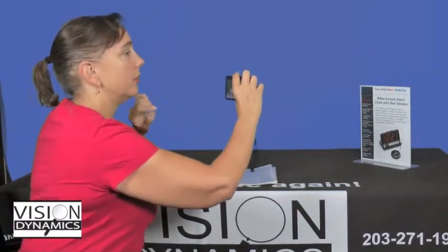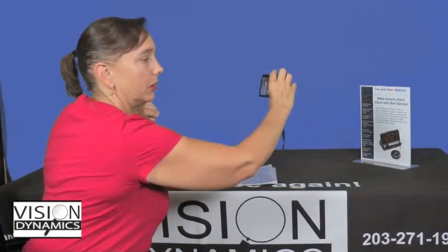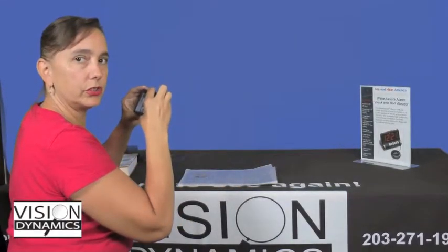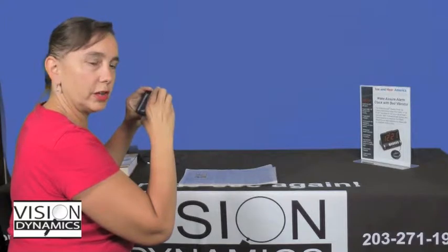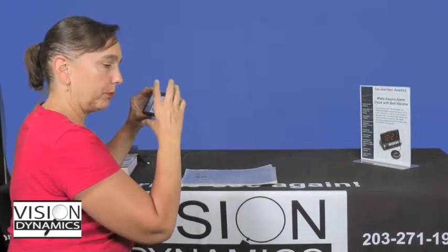And last but not least, on the very top, right in the center, is a flat button. It's oval in shape, and when you press that in, that's your capture button. From about two feet in, it will take a picture of an image. You press it, it captures the image, then you can bring the image closer to your face, and you can even enlarge the image or make it smaller or change the color combination. I'll go over these again, showing you in action how they work, but I just wanted to review.